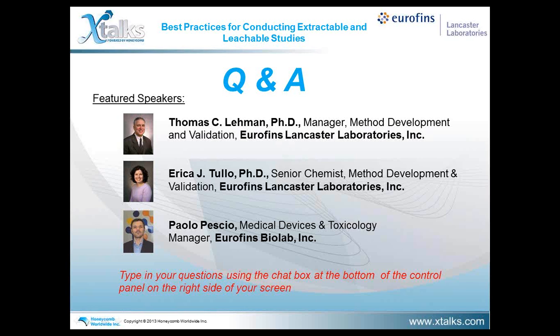Another question we have here, how much of a concern are extractables and leachables testing for oral solid dosage forms? As indicated on the risk assessment table in the FDA CDER and CBER document, they are the lowest risk for extractables and leachables, but it does not eliminate the risk.